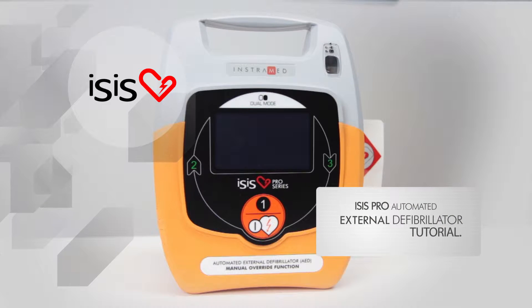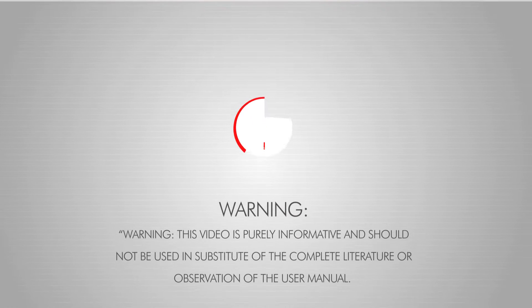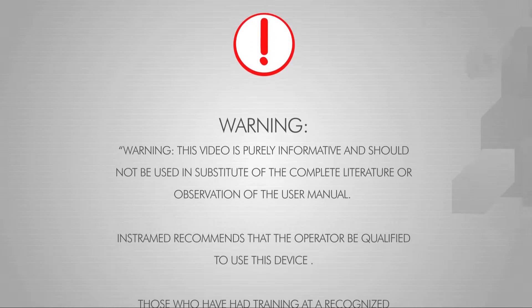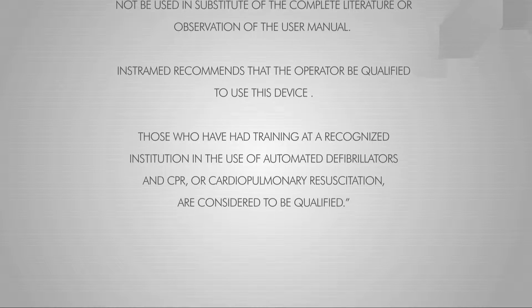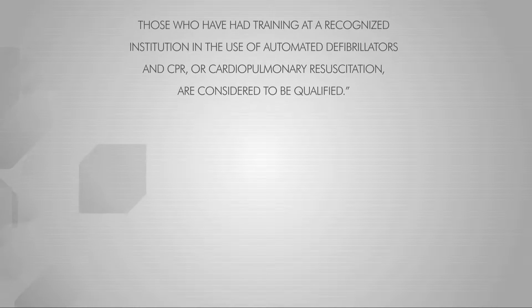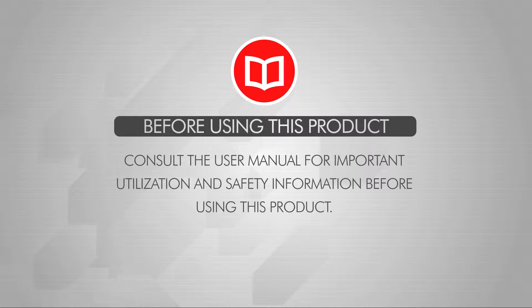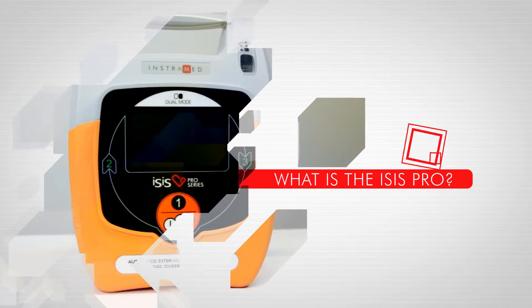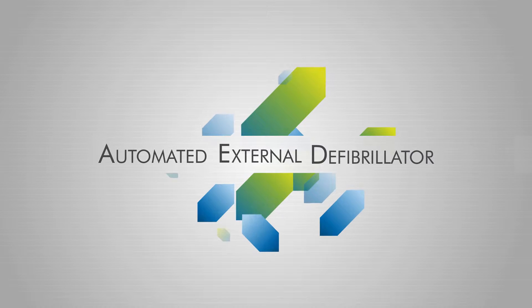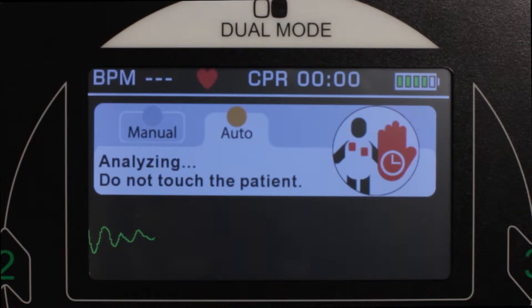Isis Pro Automated External Defibrillator Tutorial. The Isis Pro is a professional grade automated external defibrillator with EKG visualization and manual operation via touch screen.